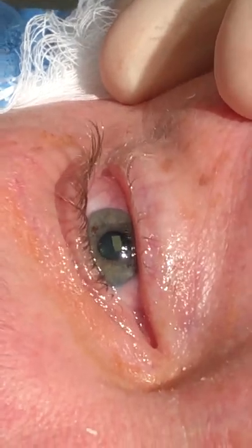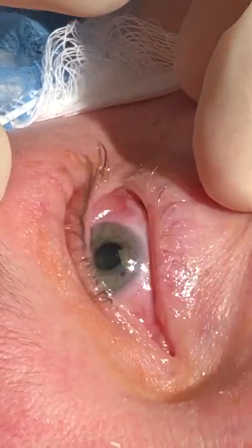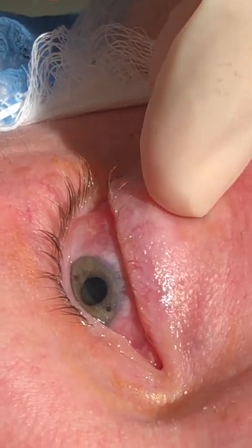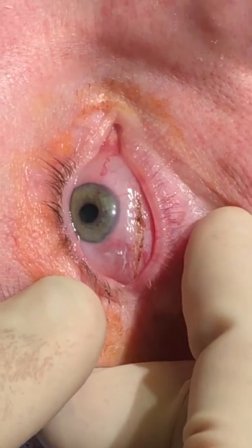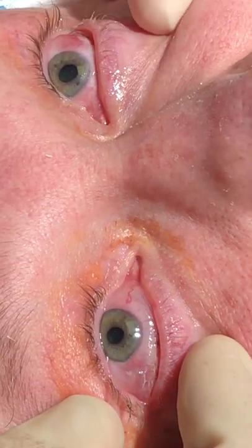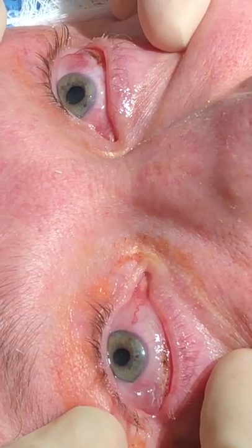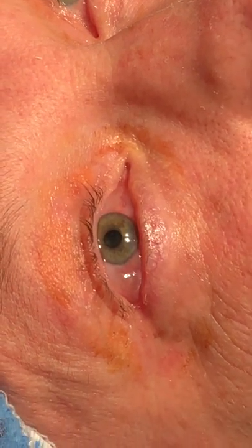You can see what we're trying to do is get the lids opposing. Look up for me, as high as you can. That'll leave a scar, but as you can see it's not a scar that anybody's ever going to see, and little by little it's going to smooth out as he goes through the healing process.